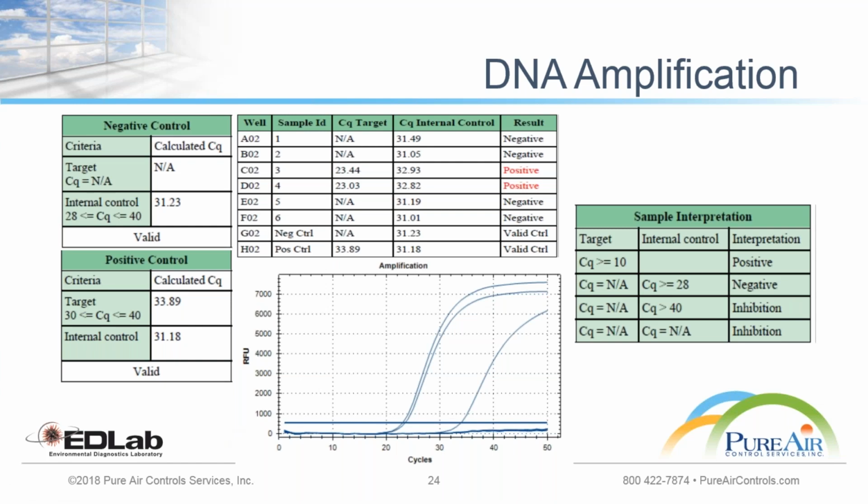Another limitation of this technique is that even if a small quantity of the gene of that particular bacteria is available, it is going to show up positive, meaning the water is somehow infested with the DNA. However, sometimes the DNA is not in sufficient quantity to form a colony on the media.